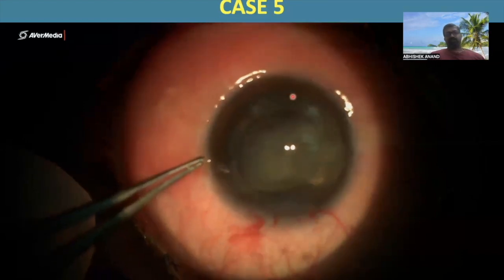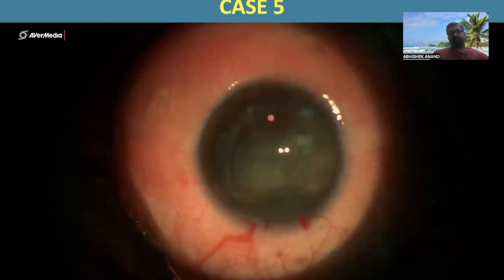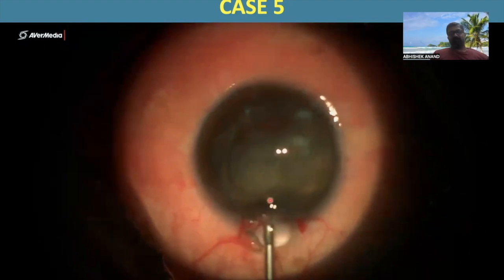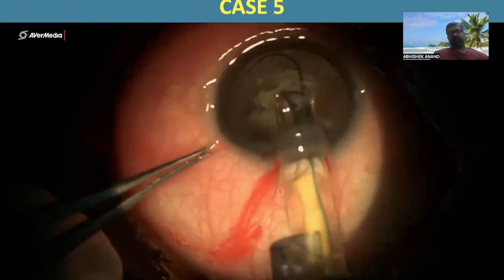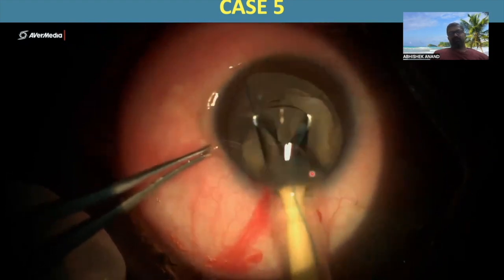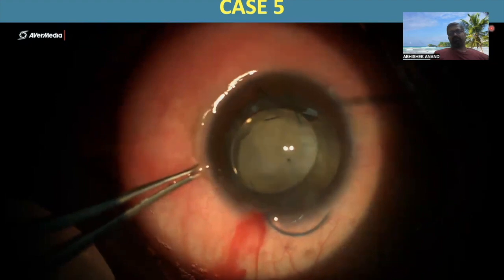Now see it with another example. Now this anterior segment surgeon has a dropped nucleus. We can also see that there is a very nice capsular rim which is left. I begin by inserting this IOL into the sulcus because I know there is a dislocated nucleus.